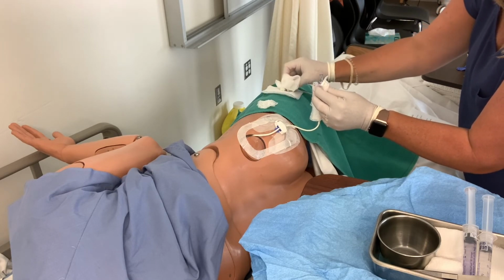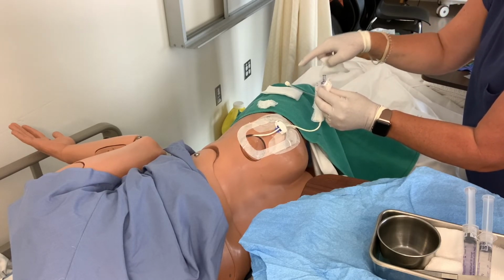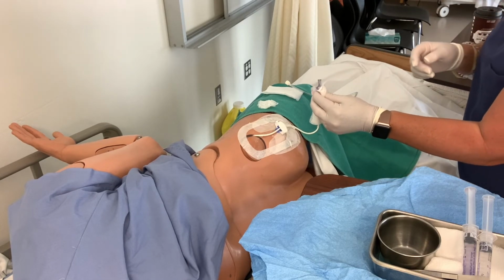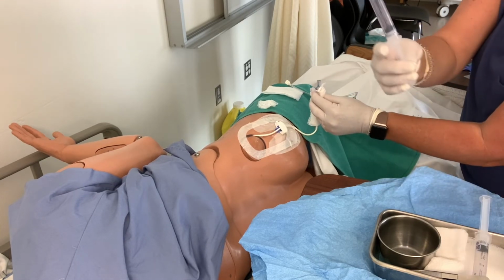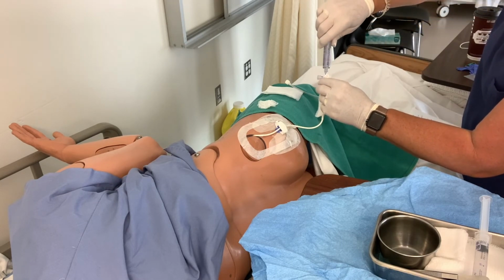That's why I have it sitting right on my sterile field, because I don't want anything to touch that end. And this can be garbage. I've got lots of sterile stuff in there that I can reach and grab. I'm going to reach up and grab my saline and put it into the port.